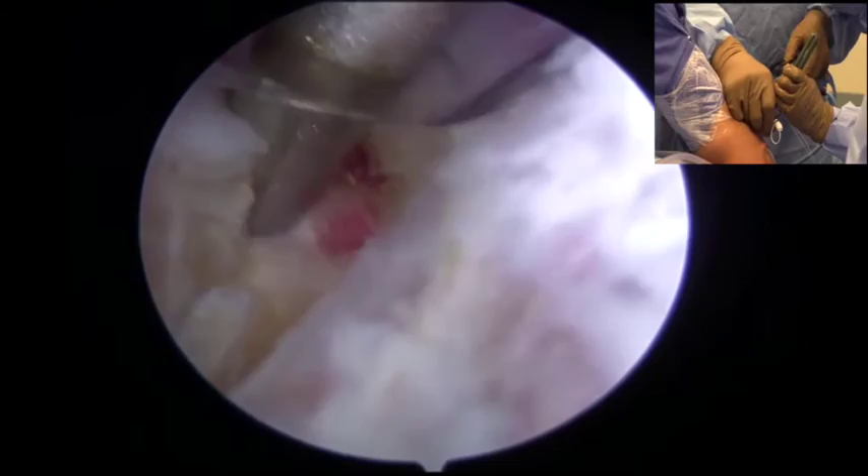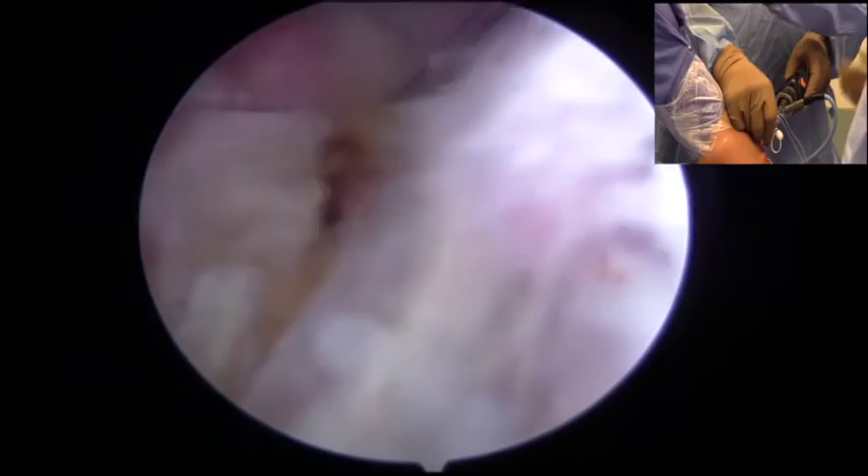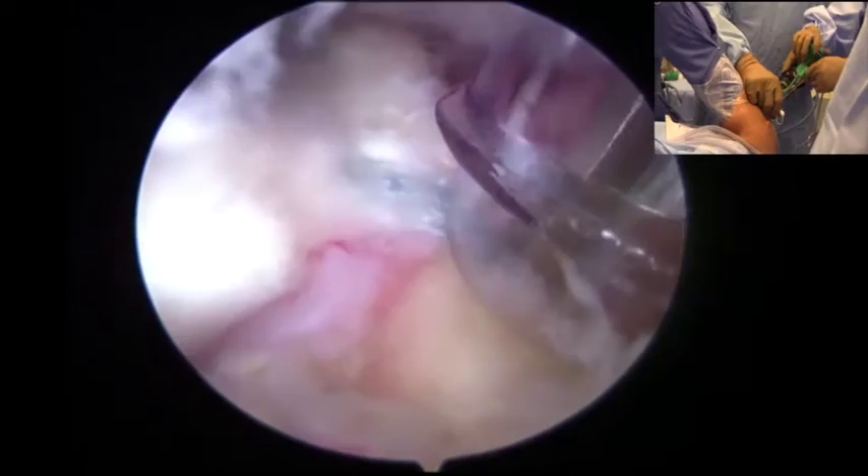Once the graft is secured medially, the lateral row is then prepared. A punch is taken to the lateral row of the greater tuberosity, and the sutures are loaded from the medial row into the lateral row anchor, which is then brought down.